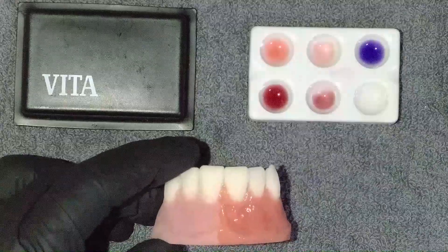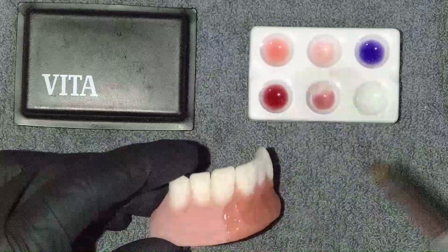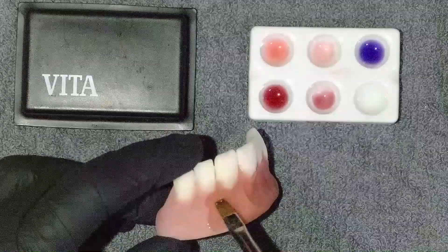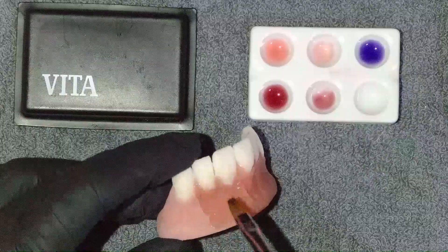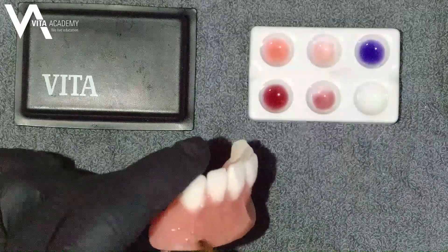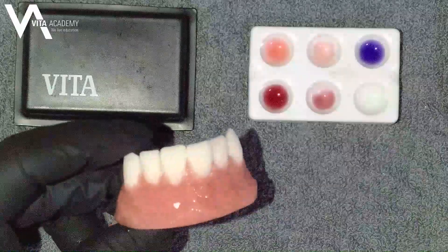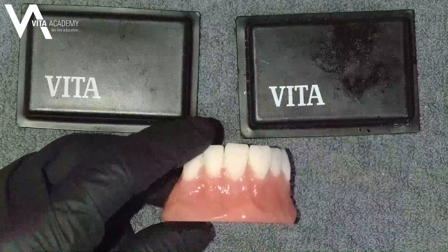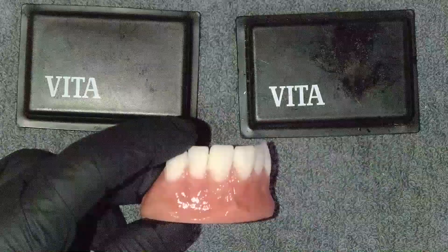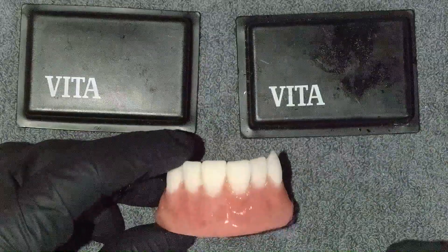The way that Julian does it is he starts with a base layer just like Axel does, except that he cures his base before he lays down any color. His technique is more to cure between layers — he does several layers in between. After curing, you can see we have a very similar effect, but it takes a little longer and a couple more steps. You can also see how we can get a lot more characterization doing it in layers.